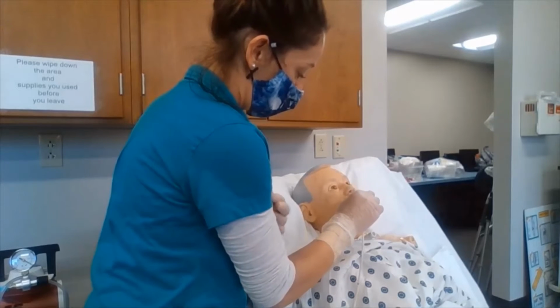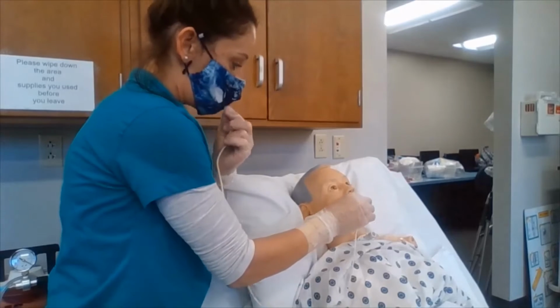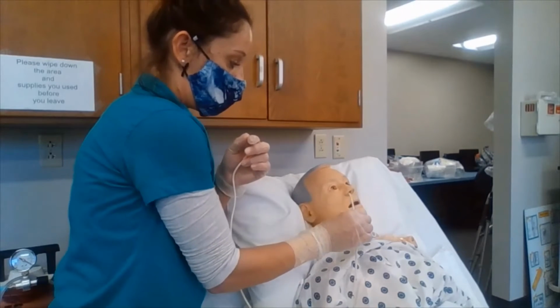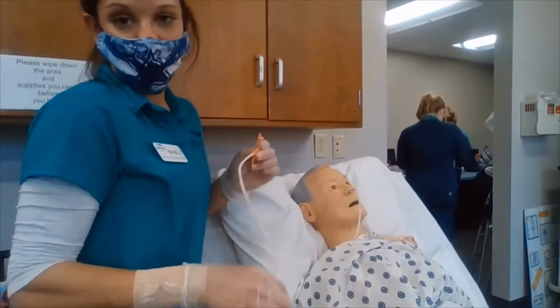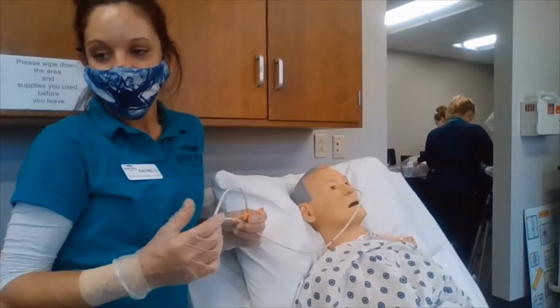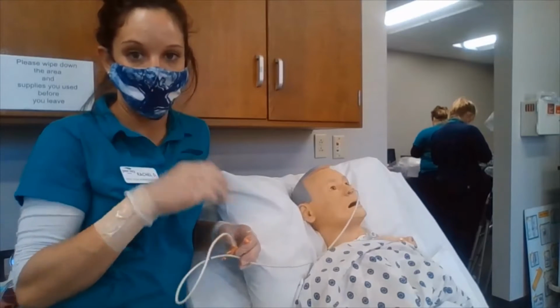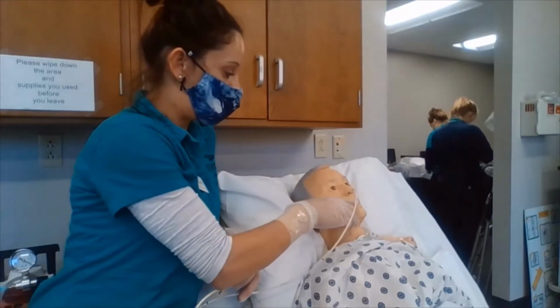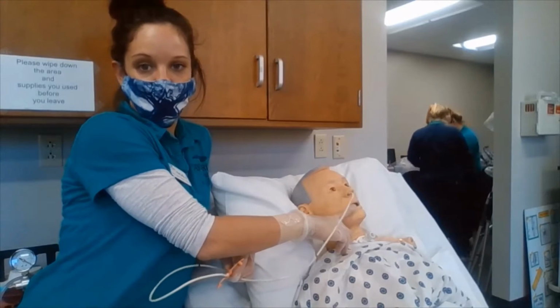amount. And if the patient does gag, we are going to stop for a minute, ask him to take a deep breath, ask him to take a sip of water. If gagging continues, then we are going to use the tongue blade and the pen light to assess and make sure that the tubing is in the right placement.